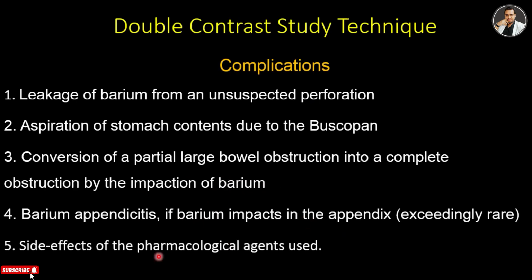And another one is side effects of the pharmacological agents. So the pharmacological agents we use are Buscopan and glucagon, and the patient may have some side effects like blurred vision or dizziness. So this should be kept in mind.